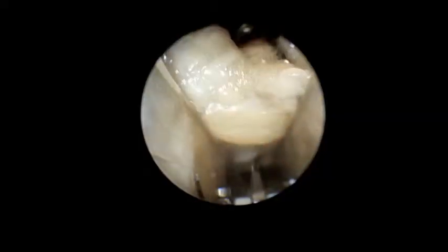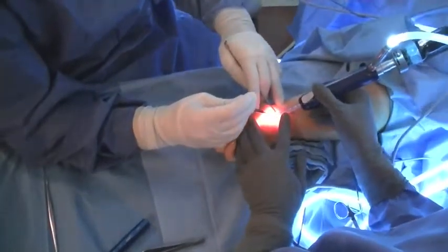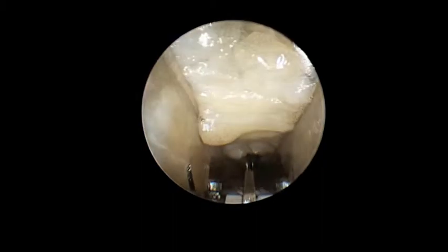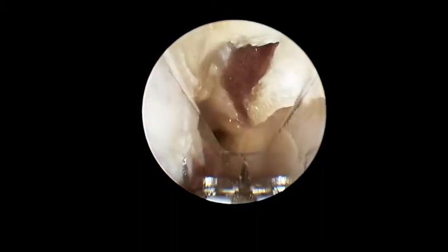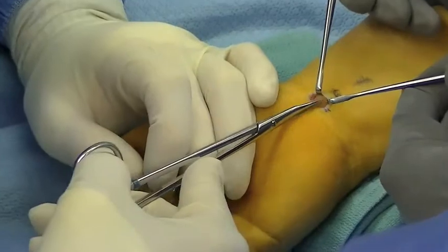The device can be removed for defogging. It's important to release the ligament going from distal to proximal. Here you can see that the entire ligament has now been released, going from the radial side with the median nerve identified, all the way over to the ulnar side, with the ligament completely divided.